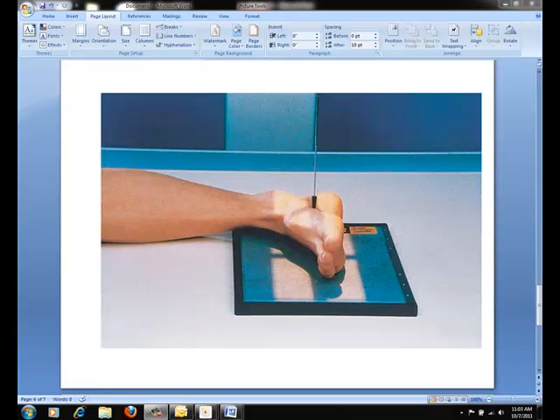The lateral or medial lateral projection of the foot is routinely used in most radiology departments because it is the most comfortable position for the patient to assume. Here, you have the patient lie on the radiographic table and turn toward the affected side until the leg and the foot are true lateral.